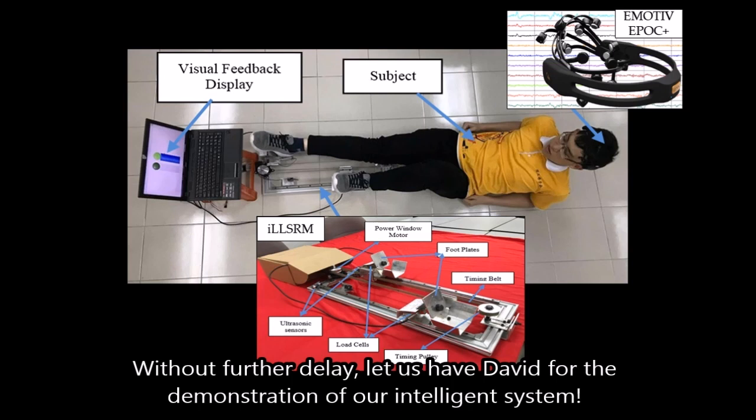Without further delay, let us have David for the demonstration of our intelligent system.